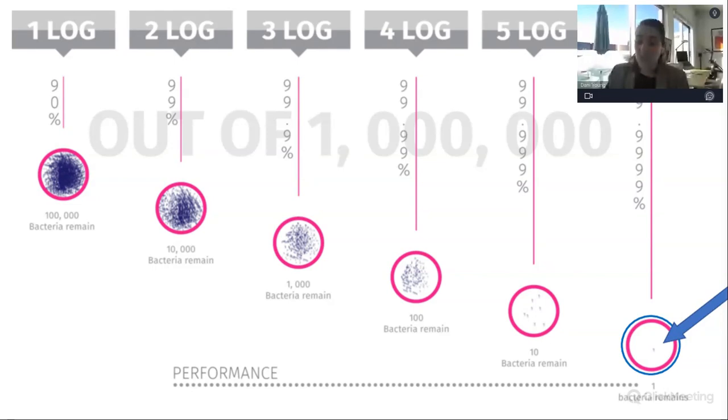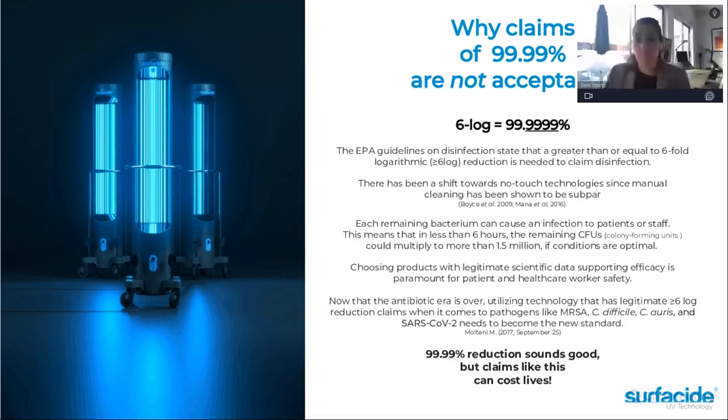I see a lot of questions about whether operatories have to be isolated and sealed, and how you use this in this kind of environment. I'm going to jump back up to this picture. So you see the light bulbs. The towers are rolled in, and they can go 360 degrees, or we can just point them in one direction. So if you have an open operatory, you put them at the doorway, they shine into your room facing the other direction, then nobody's going to be exposed to it, and you don't need to worry about that. It can go 360 degrees if you wanted it to.